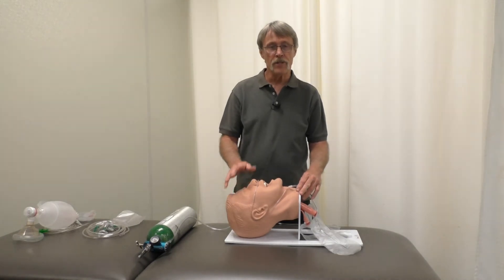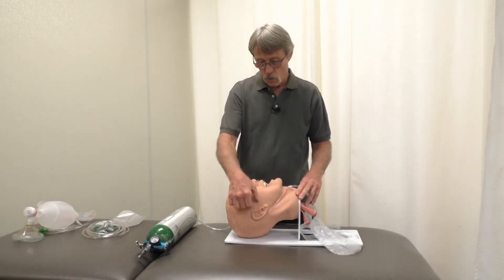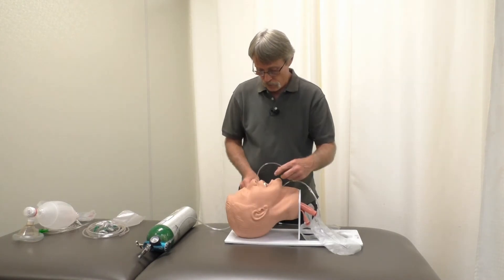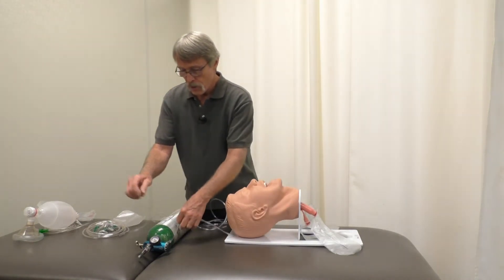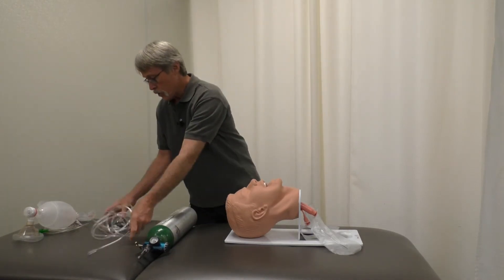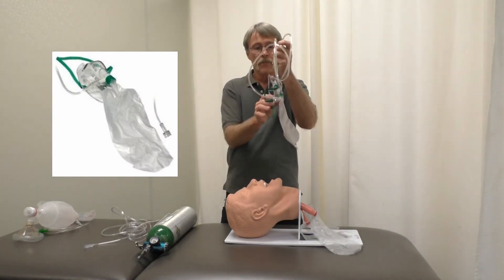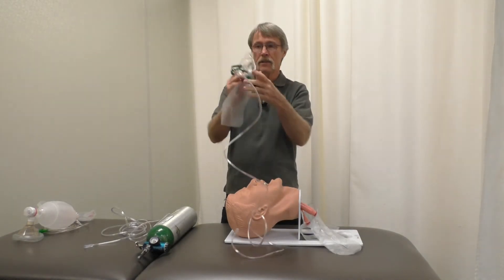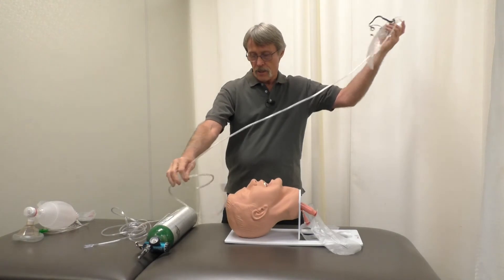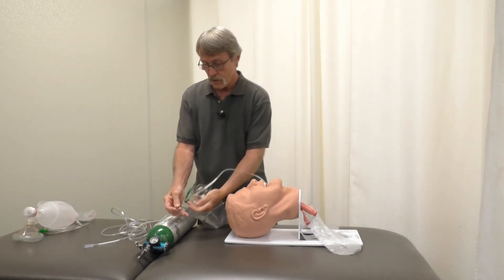If for some reason the patient needs a little bit more oxygen, you want to remove the nasal cannula and turn your oxygen regulator off. Now you're going to use what is known as a non-rebreather. This has a bag, and you hook it the same way up to your regulator.